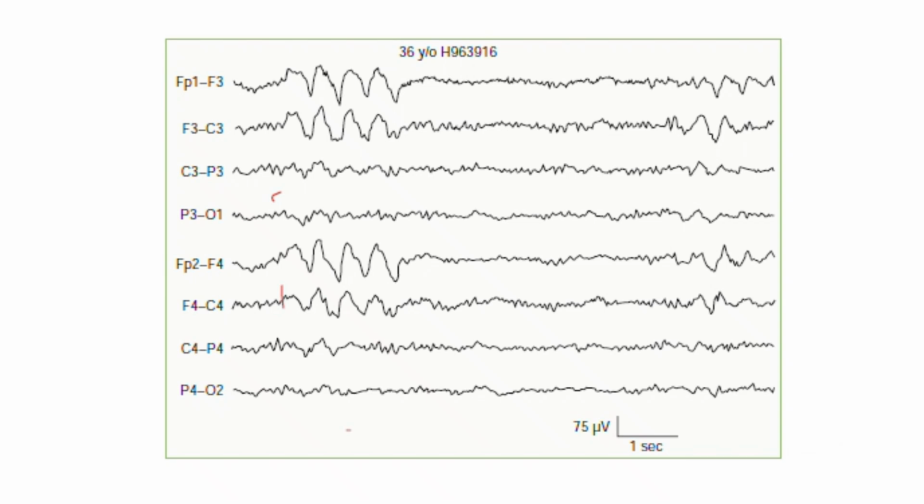3. Clinical significance in primary generalized epilepsy. While historically associated mainly with deep midline structural lesions or increased intracranial pressure, synchronous IRDA is frequently encountered as a nonspecific projection of diffuse encephalopathy or generalized genetic, idiopathic epilepsies. The pathophysiological link. The rhythmicity and bilateral synchrony of FIRDA suggest it is generated by abnormal oscillations within the deeper thalamocortical loops, the same networks responsible for generating generalized spike and wave discharges.